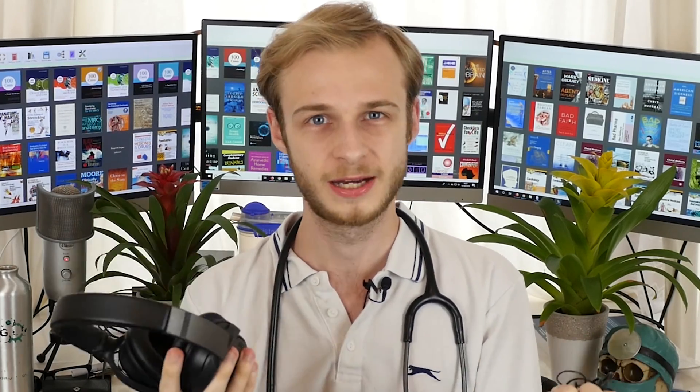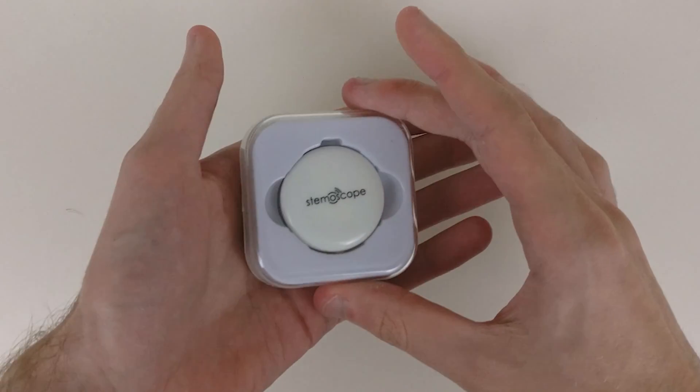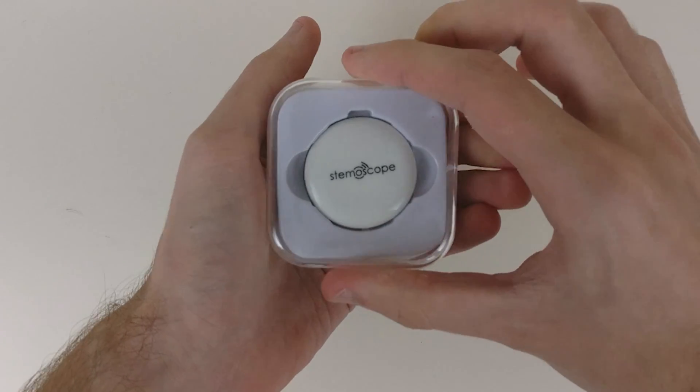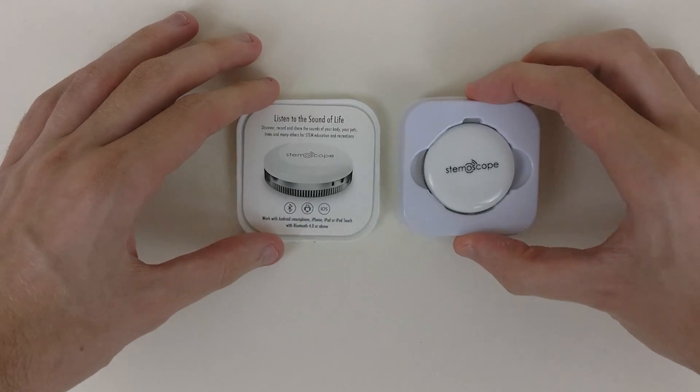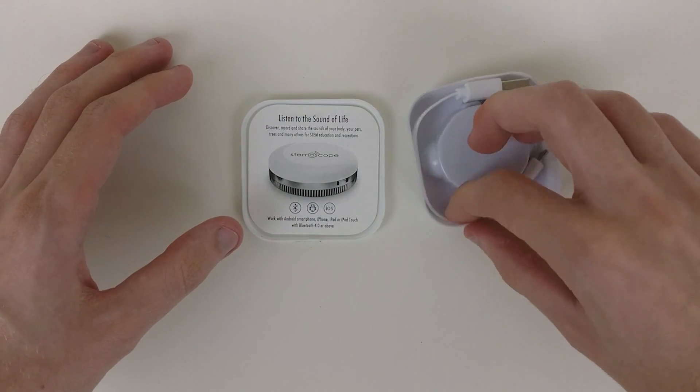The only thing I will say is that anything with a bit of noise cancelling you will benefit from, because it'll just make those heart sounds a bit easier to hear. The stethoscope itself is a diminutive little puck-shaped thing, about an inch in diameter, and it weighs very, very little — about the same as a couple of £2 coins, maybe even less. It comes in this neat little package with the device itself, some instructions, and the micro-USB cable that you'll need to charge it.